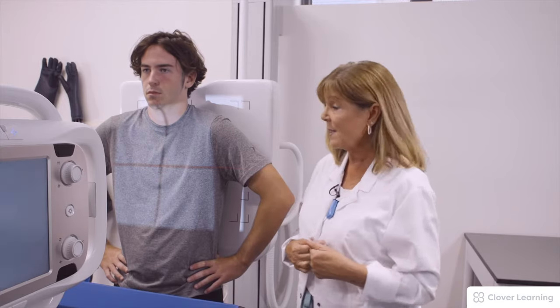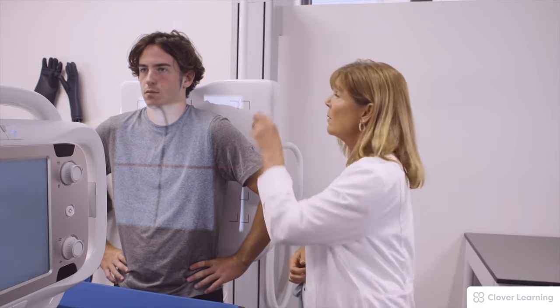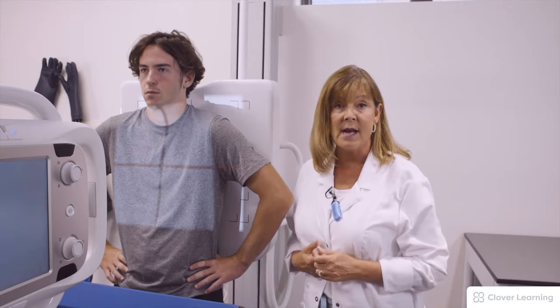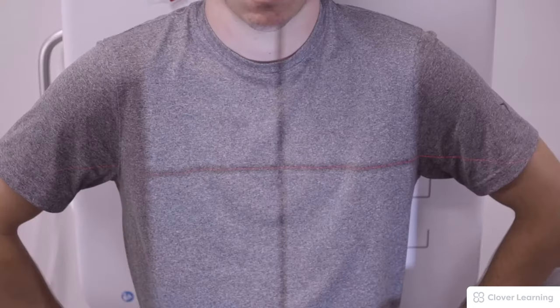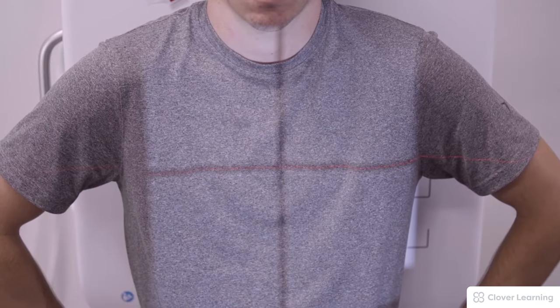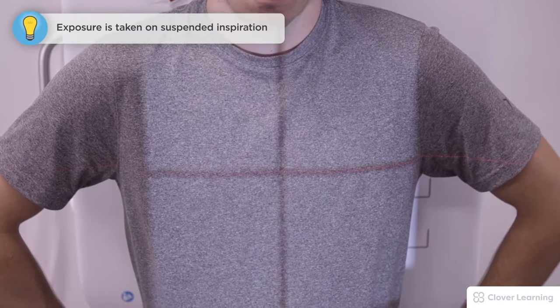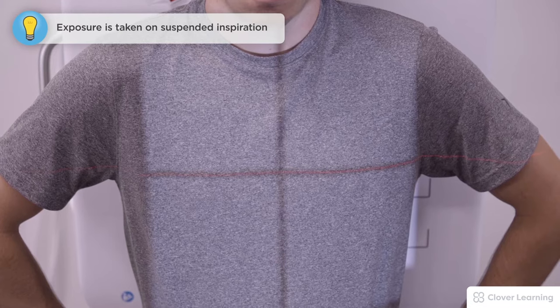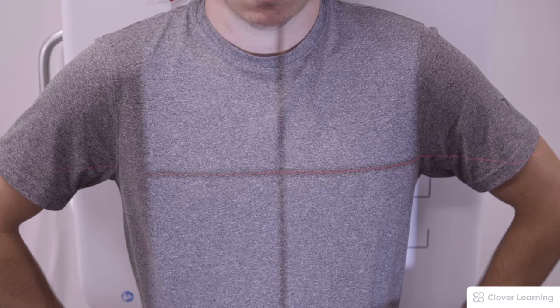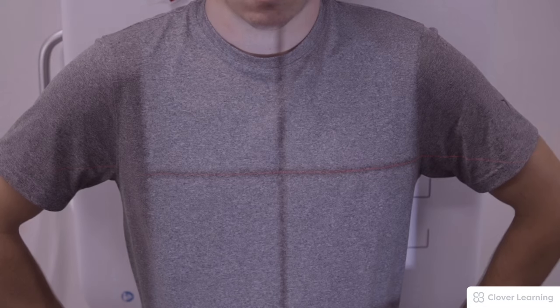We place the patient's hands on hips and roll the elbows forward slightly to move the scapulas more lateral, allowing better visualization of the ribs. A right marker is placed on the right side. The patient takes in a deep breath on inspiration, holds their breath, and the exposure is made.